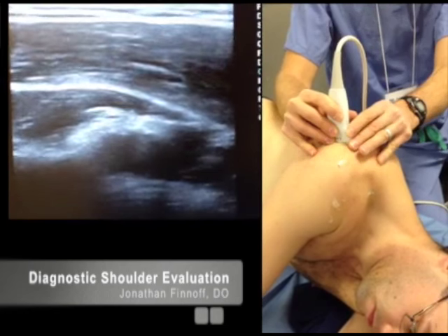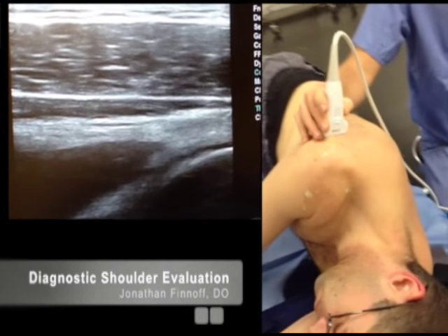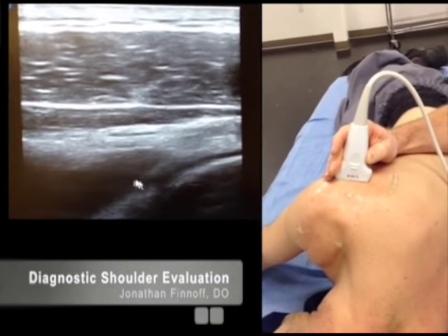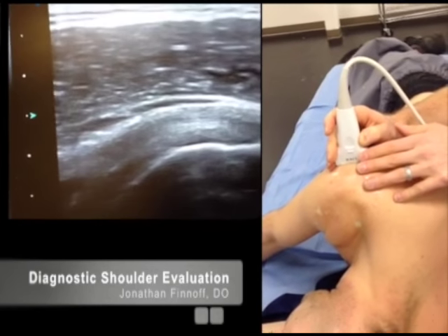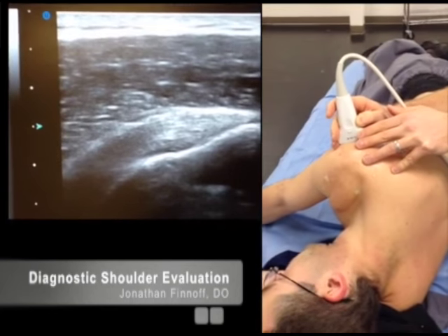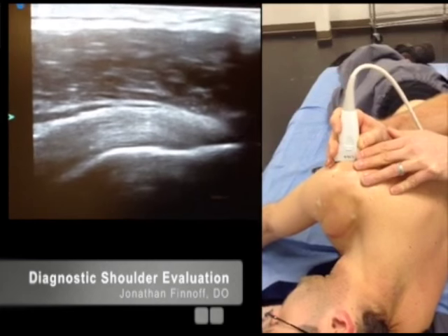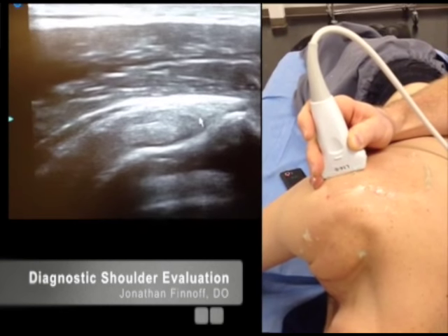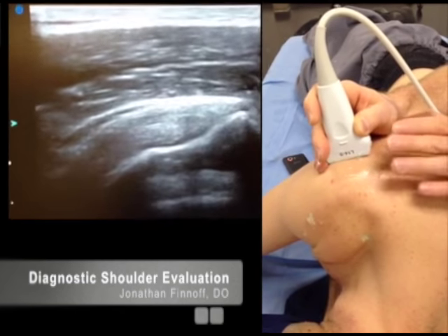Then come back medially and rotate so I'm in the long axis. Now you can see the infraspinatus tendon in the middle of the screen, with muscle deep and superficial to it. Coming over the posterior glenohumeral joint and scanning out laterally over the humeral head — there's the footprint and insertion of the infraspinatus onto the middle facet of the greater tuberosity. Always make sure you're not looking at that footprint at an angle, because you'll get anisotropy and might miscall a tear. Heel-toe to ensure your sound wave is perpendicular to the fibers at insertion.